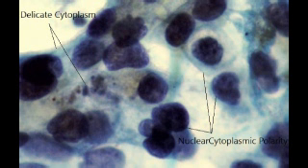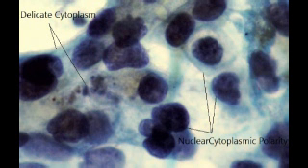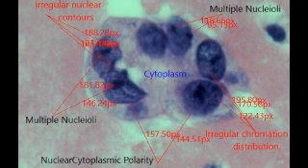Going back to the first slide, look at the cytoplasm. This is another feature you should look into. The cytoplasm in adeno usually would be delicate. It might have vacuoles. You wouldn't see it as dense. You might even see some mucin inside. It looks like a bubble where you're having fluid in it. That's called mucin. So it's not unusual for you to see those types of features.